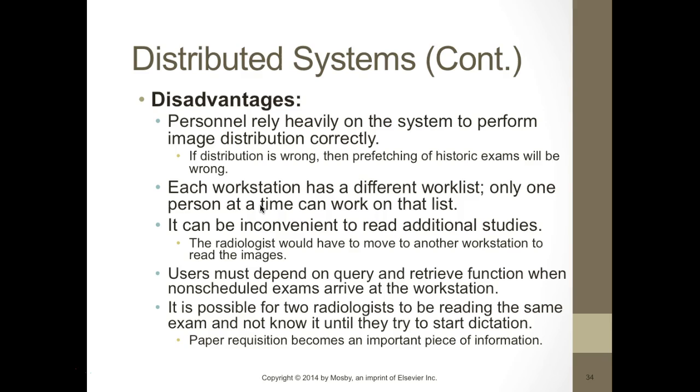So users must depend on the query and retrieve functions when non-scheduled exams arrive at the workstation. So it is possible for two radiologists to be reading the same exam and not know until they try to start dictating. So that's where the paper comes in, and it's so important that you give it to the correct radiologist.